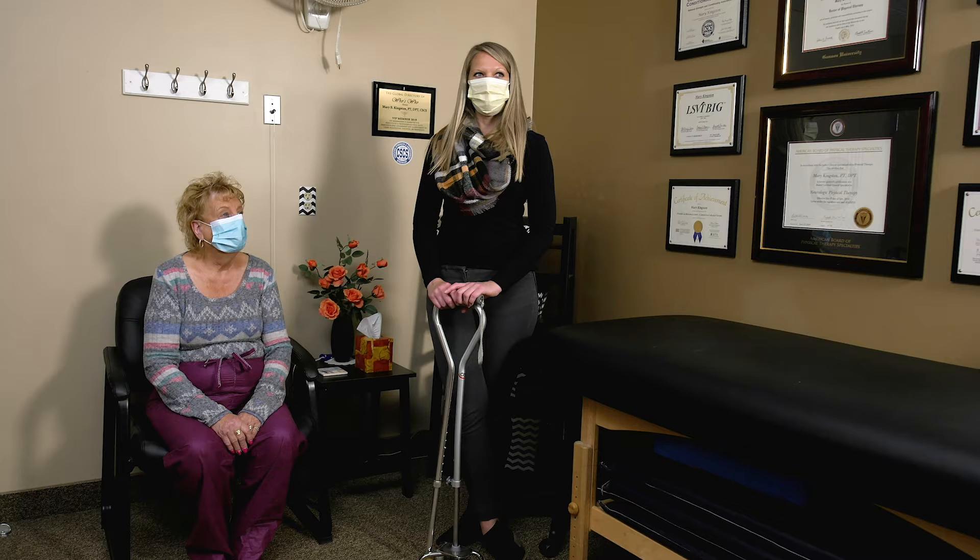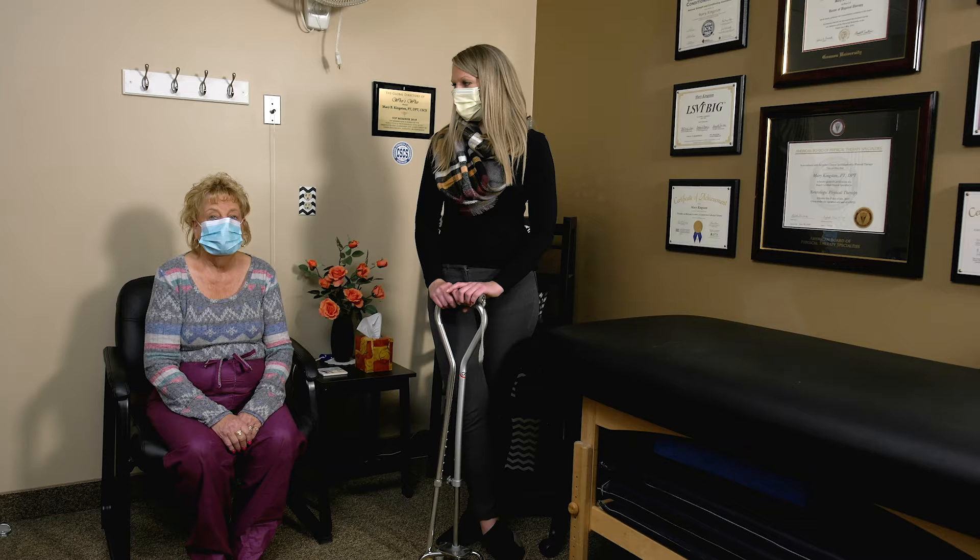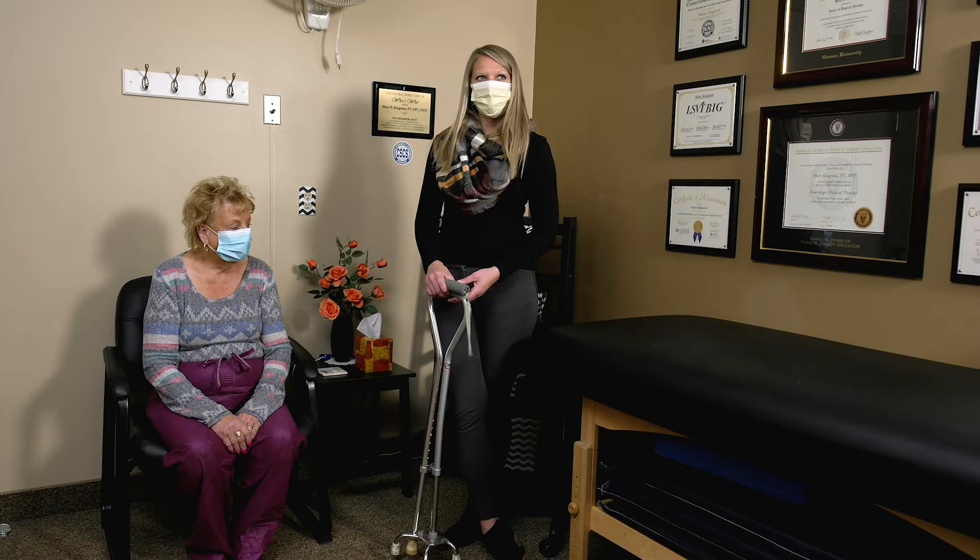This morning we're going to talk about using canes and walkers safely. It's important to know that there's no age requirement for using a cane or a walker — anyone who feels a little unbalanced or has had some falls might benefit from using a little bit of support to walk with. When you use a device, it's important to make sure that it's the right size.